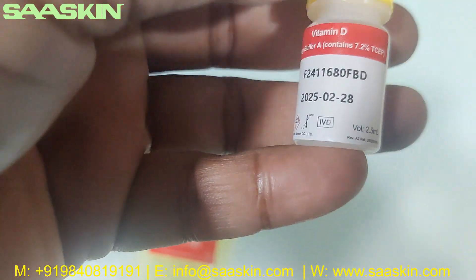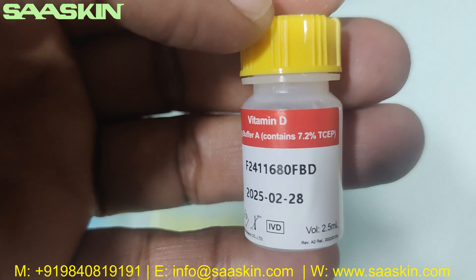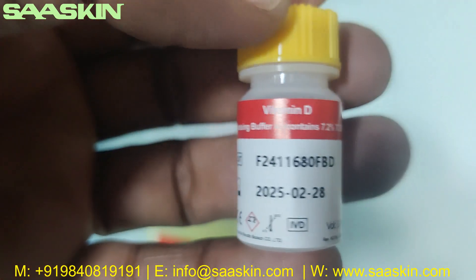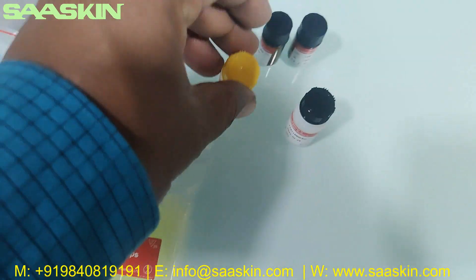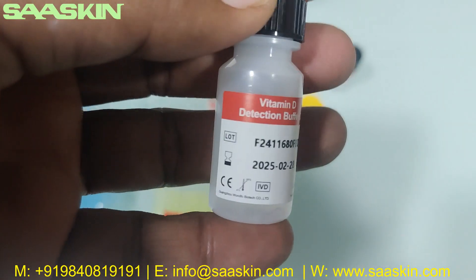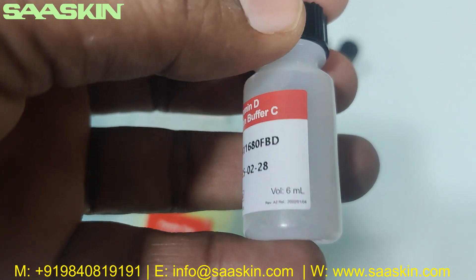Then you have one more bottle — this is releasing buffer A, containing 7.2% TCEP. You can see it also has a lot number and expiry period. This is a 2.5 ml bottle. There is also one larger bottle — that is the Vitamin D Reduction Buffer C, a 6 ml bottle, also with a lot number.